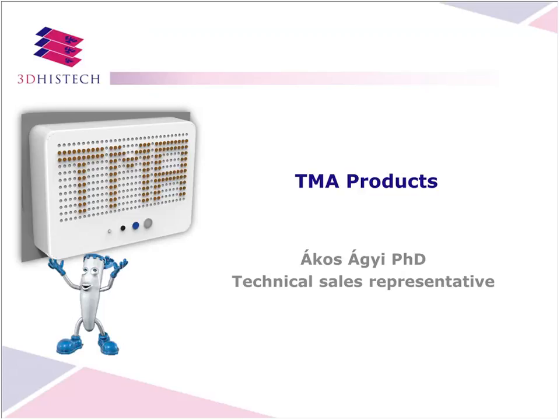Today, I will show you our TMA products, our tissue microarrayers with PCR function.